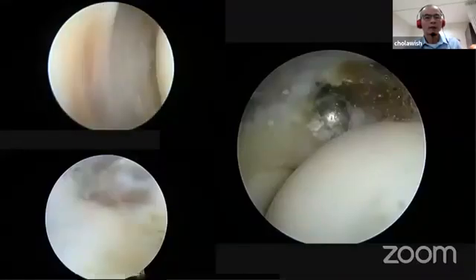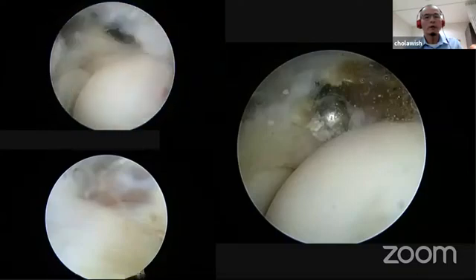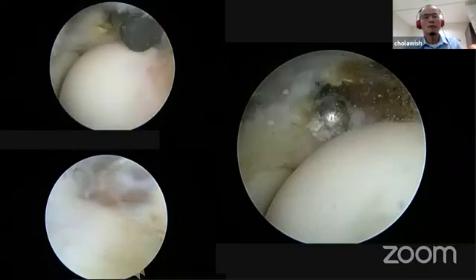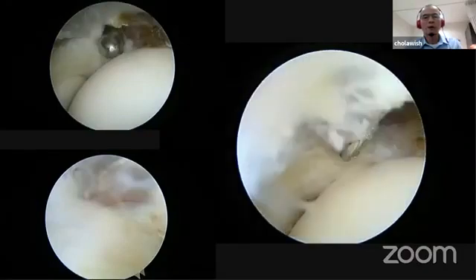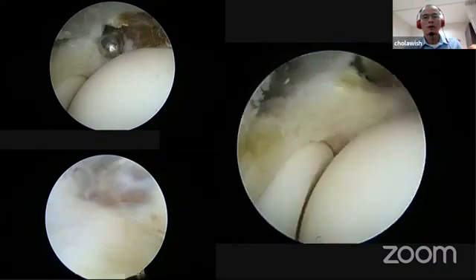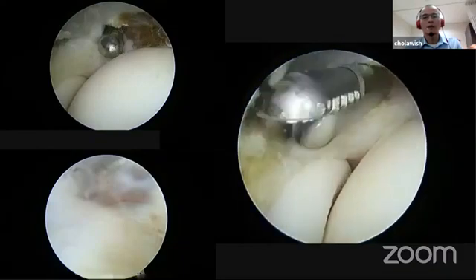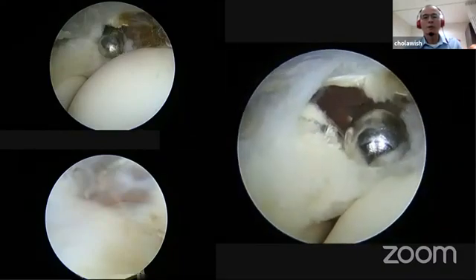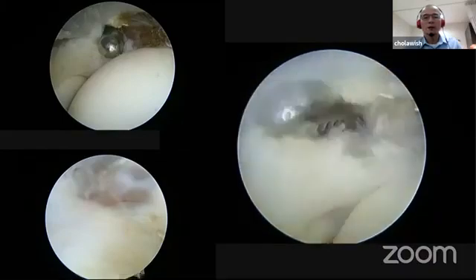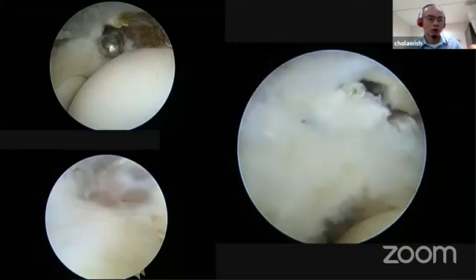This is a video clip showing the front view, with synovial impingement on the anterior side. After we divide and do the plica excision, I found calcium spilling out into the joint. So I start to divide the calcified deposit in the tendon too, the same as we do for calcific tendinitis in the shoulder.